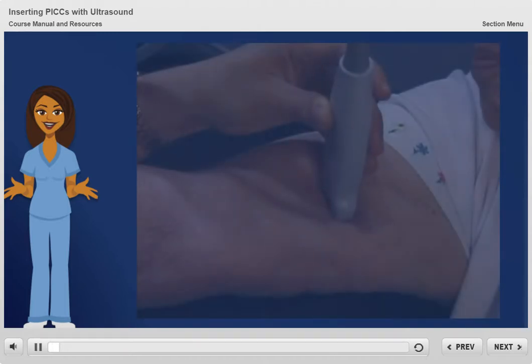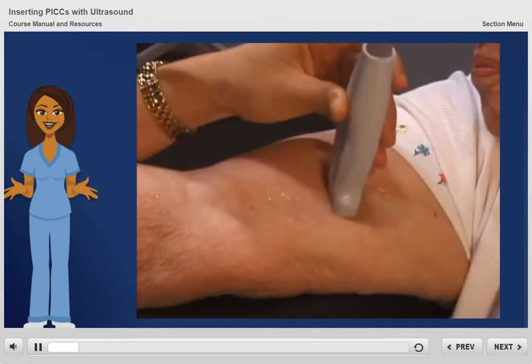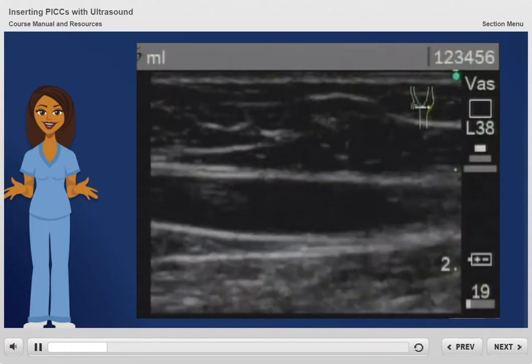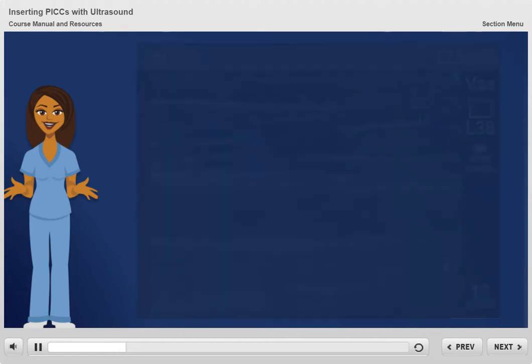The use of ultrasound guidance has changed the way we place PICCs. Ultrasound allows us to not only locate veins, but also to assess the veins to determine which one will provide the safest and most reliable access to our patients.